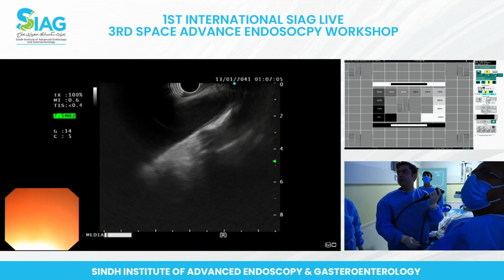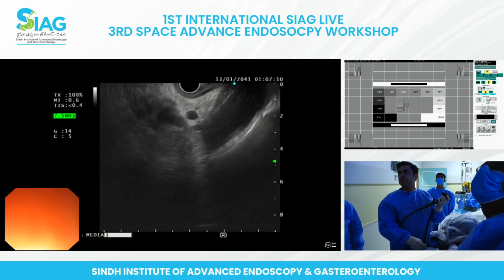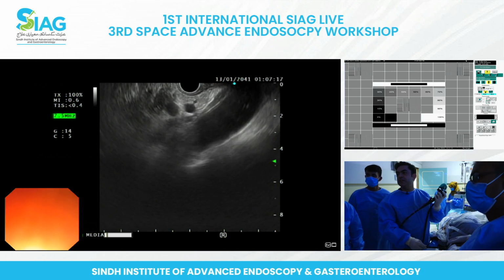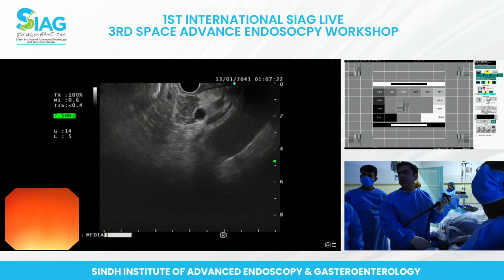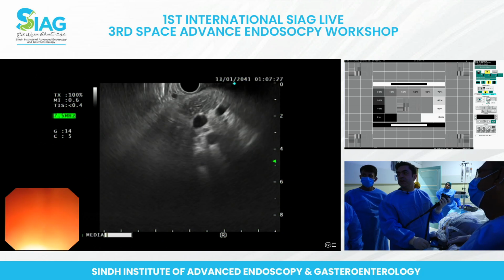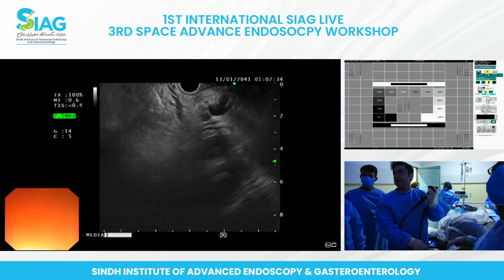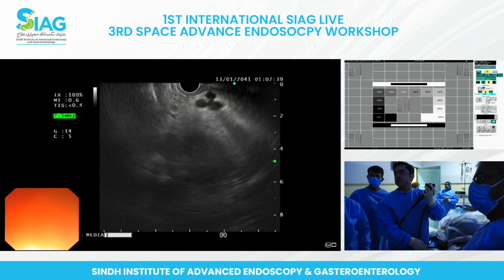The fluid is, so just from an EUS perspective, we've got the aorta, the first vessel coming off is the celiac. We can see the celiac axis coming off there. The celiac axis then will change into the splenic artery. The images are not very brilliant, but you can see certainly the splenic vein there and the PD, some changes in the pancreatic duct. So I'll just move towards the tail of it.